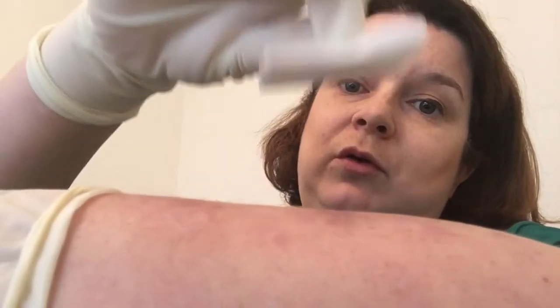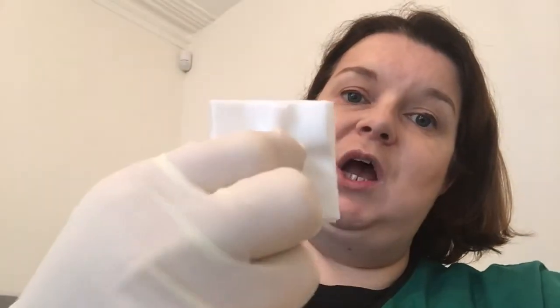If I was getting ready, I can open it, close it back up, and come back to it because it's going to stay sterile and safe as long as I don't knock it — and beware of that in the exam. Then when I want it, I can pull the back and all I'm doing is pinching like that. So the shiny side is going to go on the patient, and I've got hold of the back, so I haven't touched the wound-side surface — that's the way to handle it.